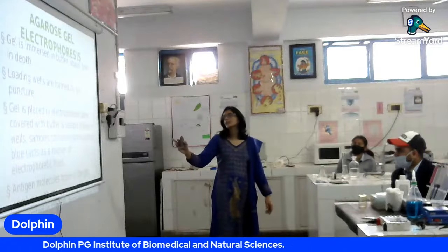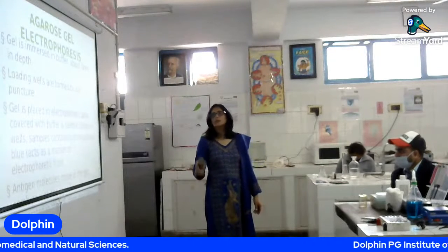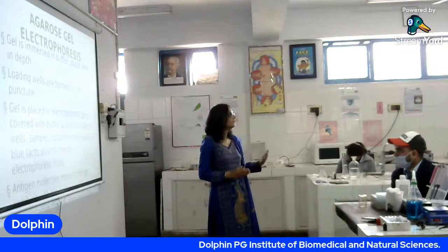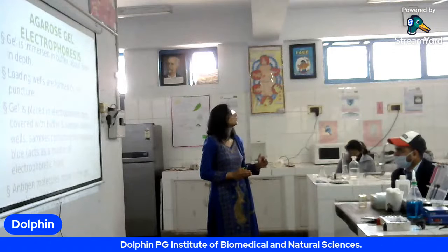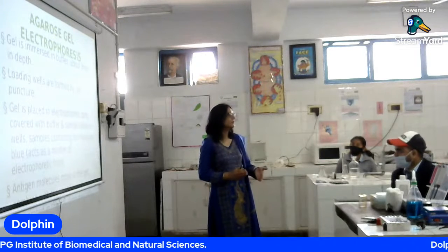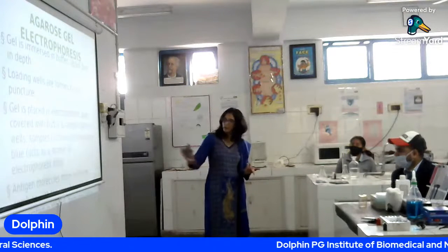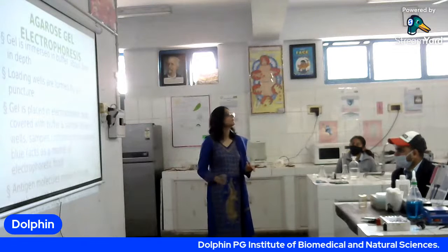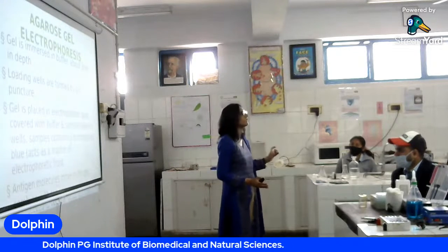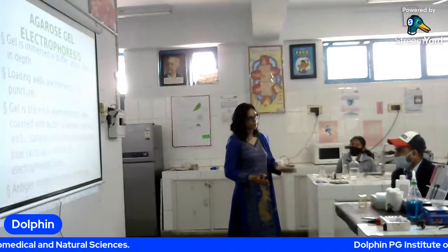That dye is bromophenol blue. So it acts like a marker. एंटीजन को हमने कहां डाल दिया है? तो रिमेंबर जो सैंपल है, सैंपल में क्या है? सैंपल कंटेन्स द एंटीजन. So our sample is, we are looking for the antigen, and now where is this antibody? और तो यहां पे कुछ मिस हो रहा है. So what is the antibody? एंटीबॉडी इज एडेड इन द agarose itself. So we are providing the antibody in the agarose.